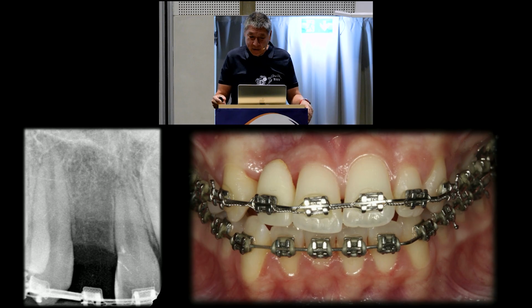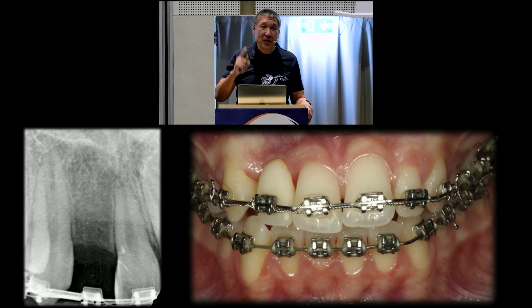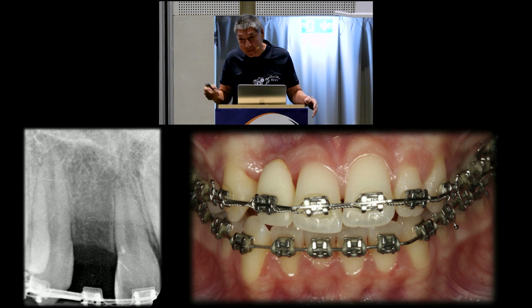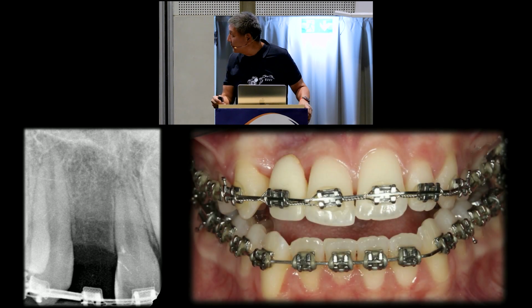So the patient's not happy. She doesn't have any competency of the anterior teeth. She's only congenitally missing one tooth, the maxillary right lateral incisor. The question is, are her other teeth the right size or not? That's really the question. So, she has her lower anterior teeth.